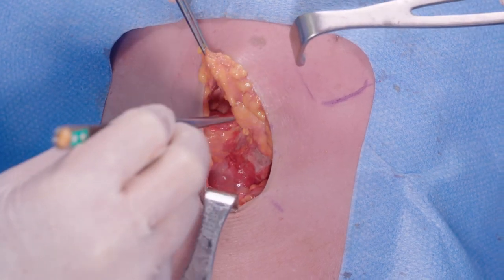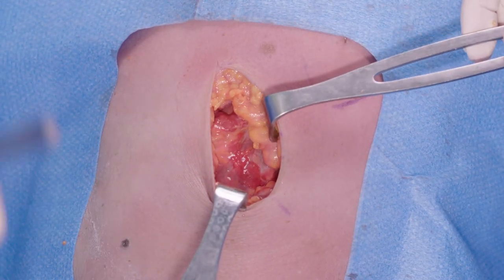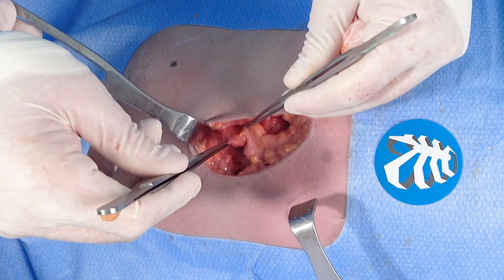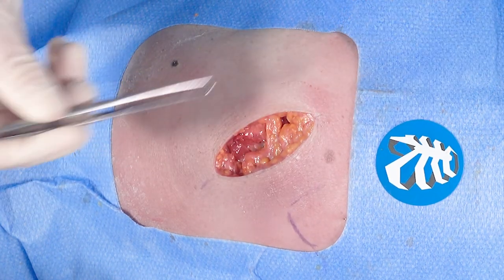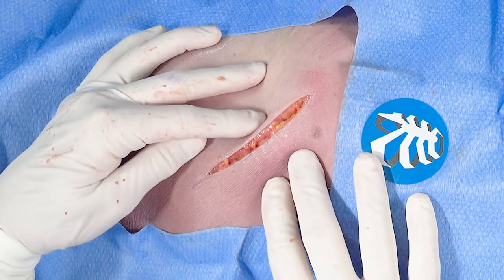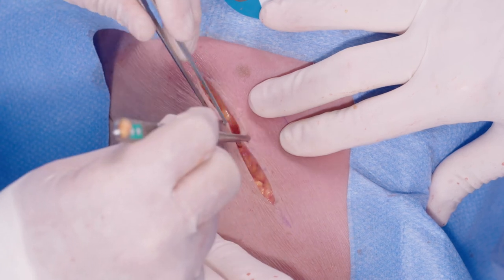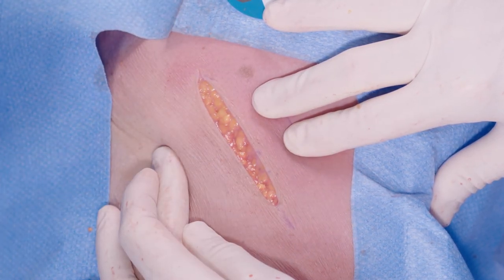We will close the serratus muscles along their fiber length, generally with a running absorbable suture. We will do the same with the latissimus dorsi as well. This covers our hardware, restores the normal anatomic positioning of the muscles, and then gives us access to the subcutaneous tissues. I will run an absorbable suture in the deep space, then a subcuticular suture, and then on the skin, sometimes staples, sometimes fine suture with Dermabond — all done through an incision that's less than five centimeters.